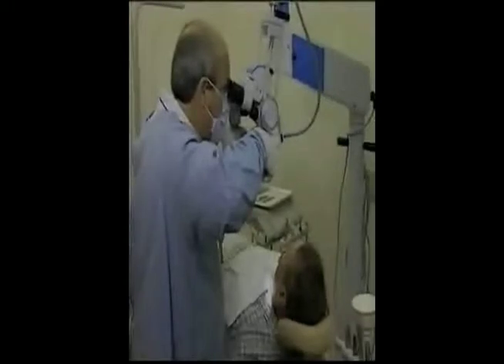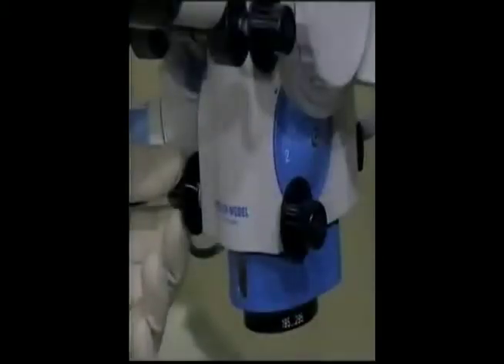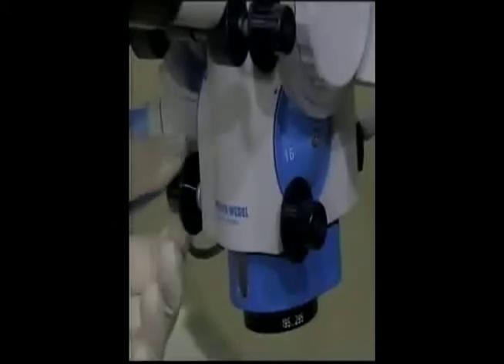Once in a comfortable operating position, you can choose five magnification levels depending on the working distance you like and the procedure being done. It's easy to change magnification from 2x up to 24x with the turn of a simple knob.